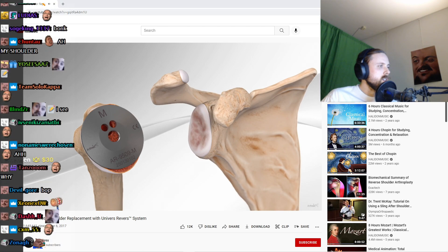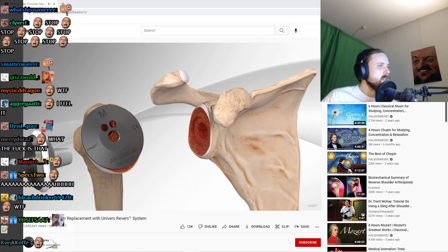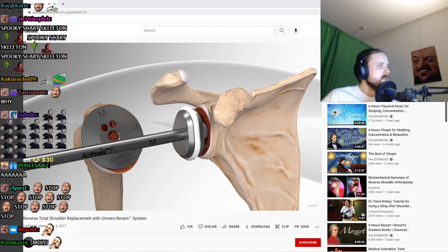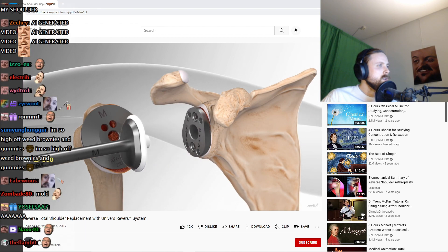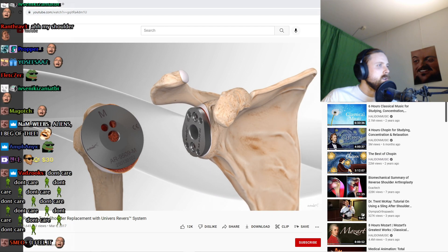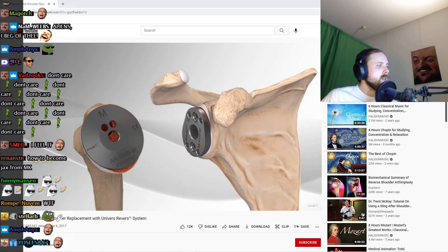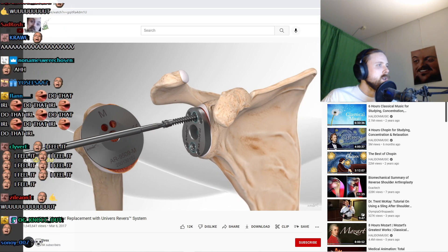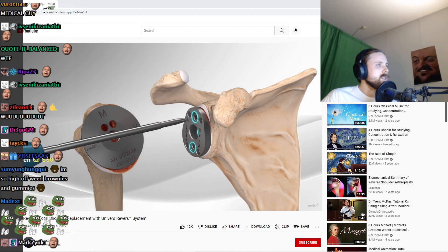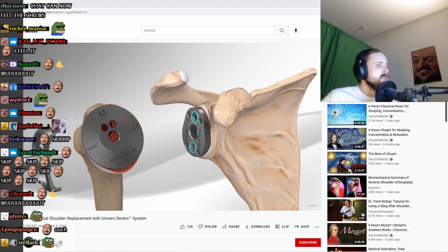Attention is then turned to preparing the socket. A series of instruments is used to mold the socket into the shape of the implant that will be secured to the bone. The size of this implant is based on the patient's anatomy. A flat metal plate is secured to the socket with three screws. Remaining bone and soft tissue from around the plate is removed.